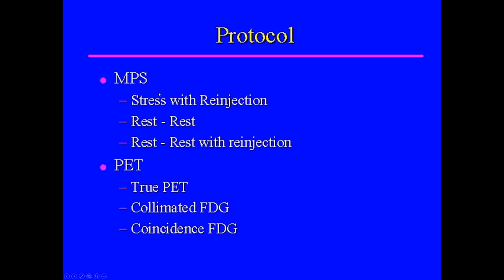For example, myocardial perfusion scanning with thallium. You can do a stress test followed by rest studies and reinjection to get delayed images up to 24 hours. And what you want to see is that there's ischemia, of course, in stress, which does not change with the rest, so you get a fixed defect. But on further delayed imaging following reinjection or just prolonged delay, that defect you're seeing should fill in, which would suggest that there's viability. If it doesn't, it would suggest infarct.